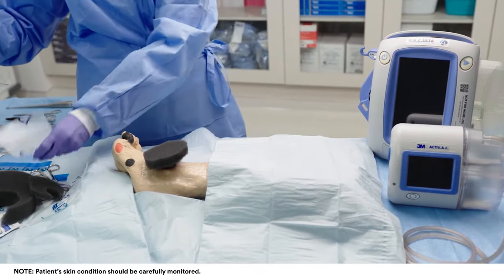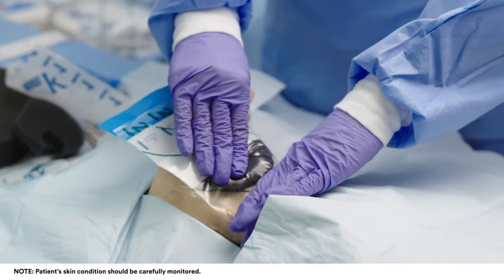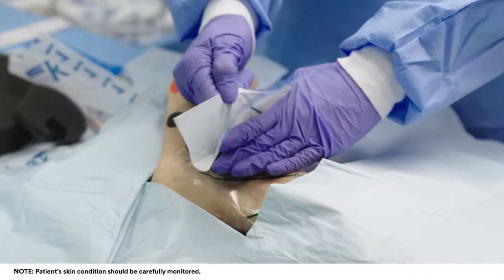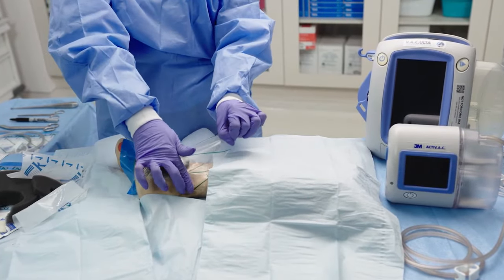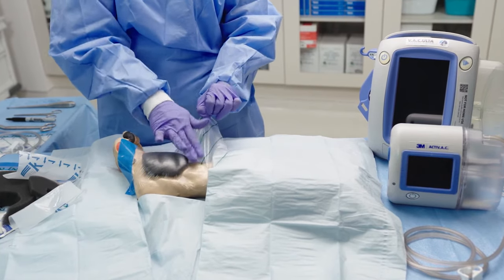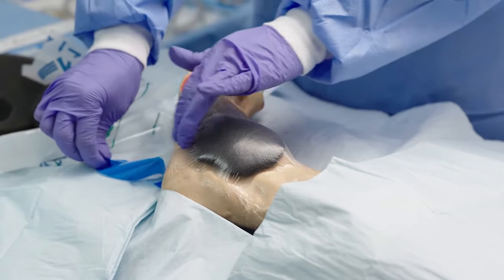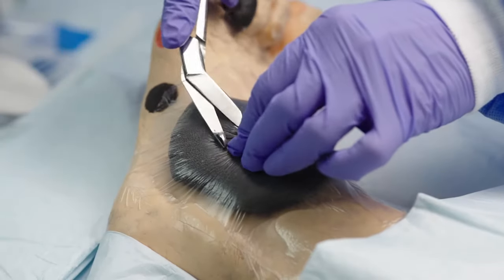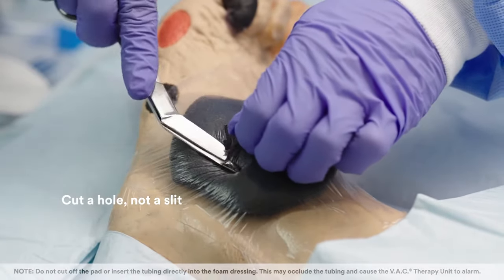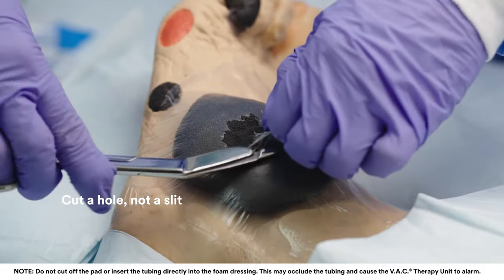Trim and place the drape to cover the foam dressing and an additional 3 to 5 cm border. Pinch the VAC drape and carefully cut an approximately 2.5 cm hole — not a slit — through the VAC drape. The hole should be large enough to allow for removal of fluid and exudate. You do not need to cut into the foam.